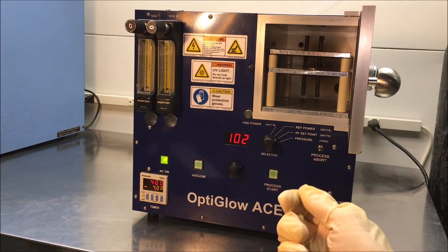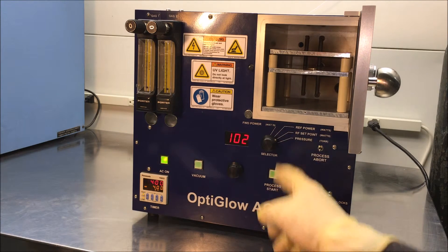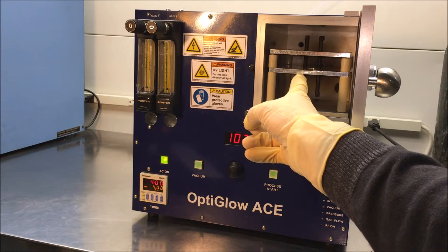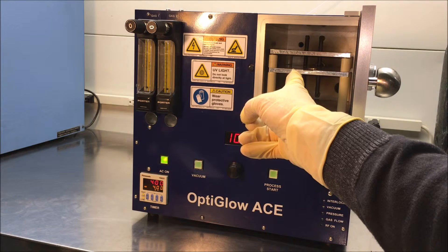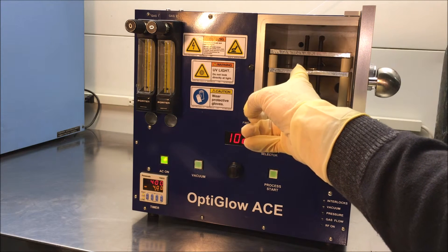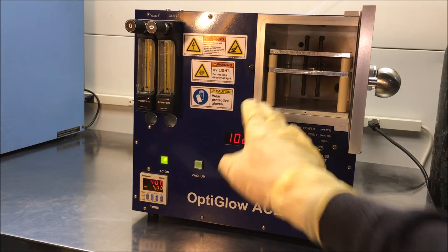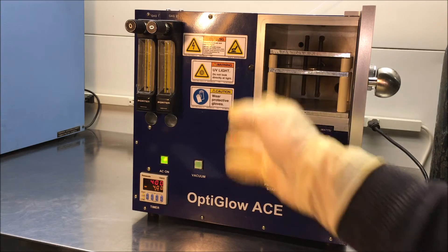Just to run this in reverse: you would want to put your samples in the chamber, then close the door. On this particular shelf right here, this is a powered shelf. So if you put your sample on this shelf, it will have more of a RIE effect and maybe a little bit more aggressive processing depending upon what type of samples you're running. If you put your samples either here or here, they would be on the grounded electrode. You can see that there's a rail on the back of the system that attaches to either the power or the ground.